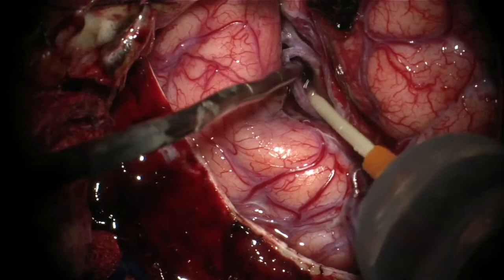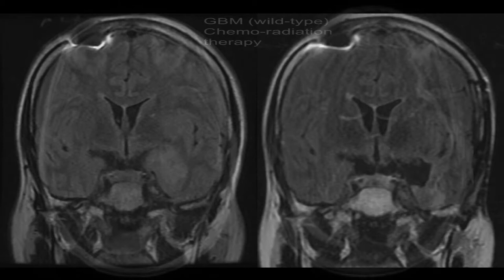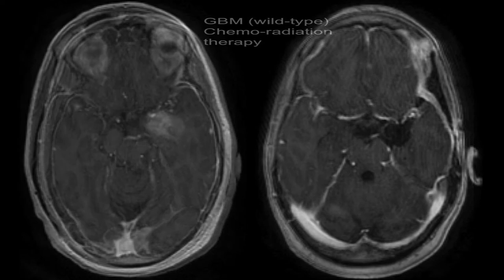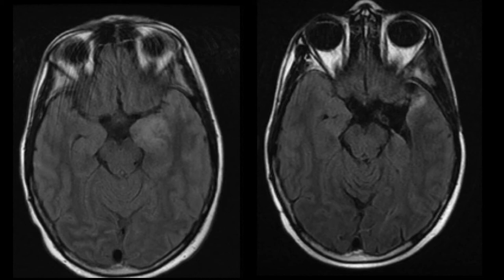Repositioning the early temporal branches. And now our post-op MRI with a complete resection of the tumor. The patient underwent chemo-radiation therapy. This was diagnosed as a wild-type glioblastoma multiforme. The patient had no post-operative deficits and no further seizures.